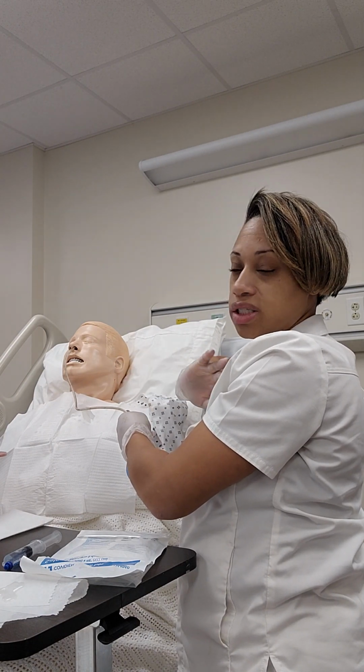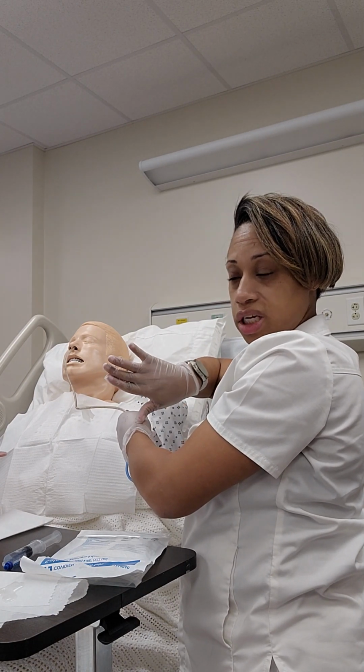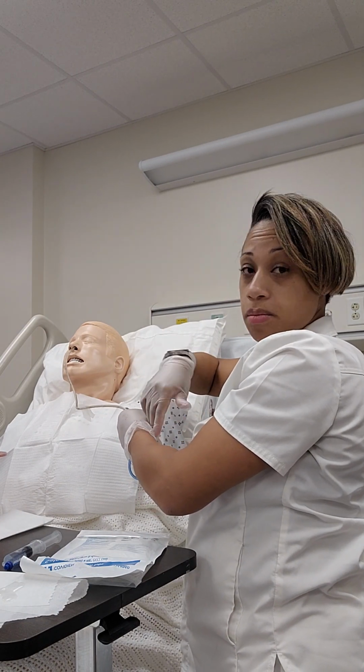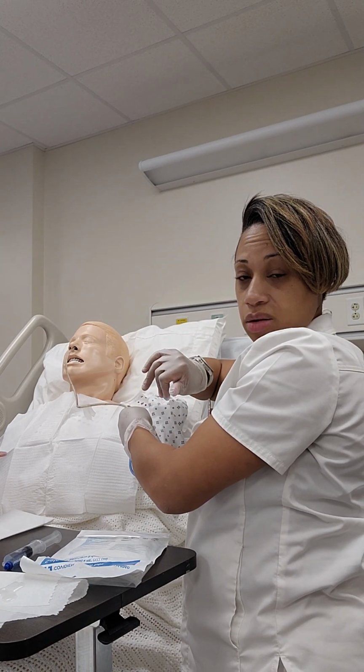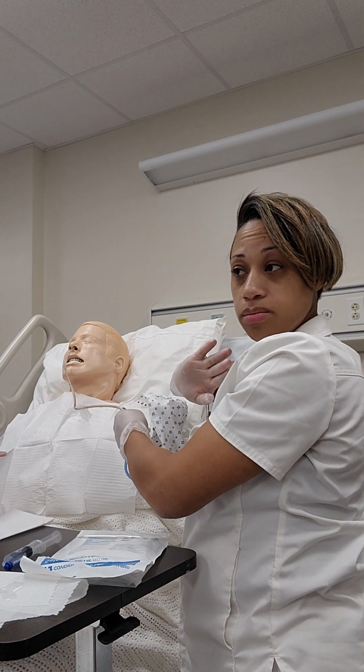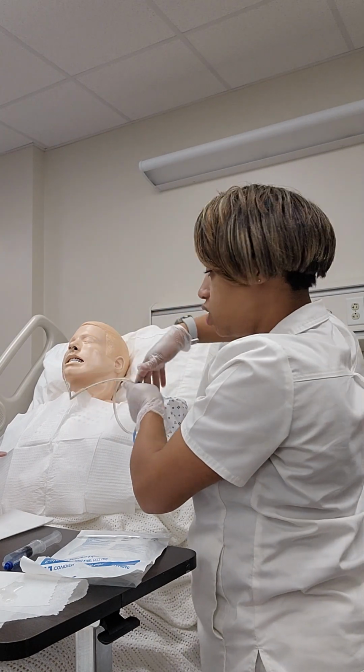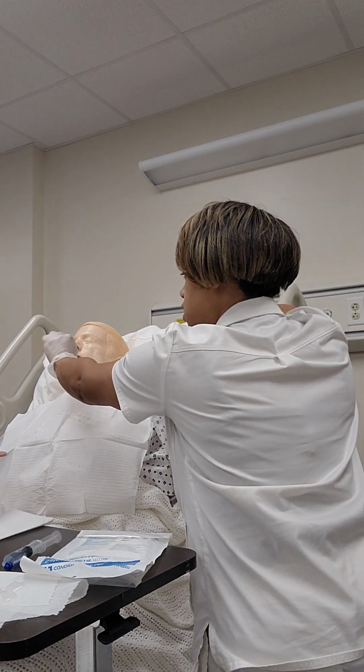Now, if the patient shows any signs of distress, like coughing, gasping for air, cyanosis, any type of distress, of course, I will stop the whole procedure and remove the tubing. But since my patient is not having any problems with the tubing placement, I will continue on until I get to the point.